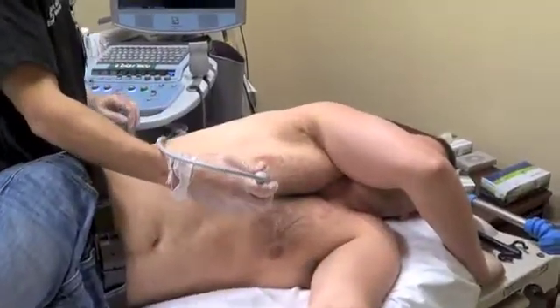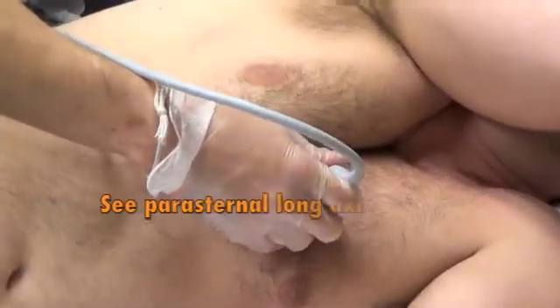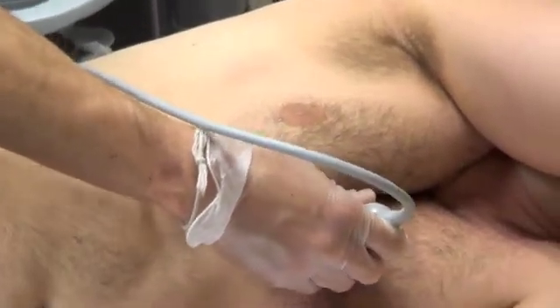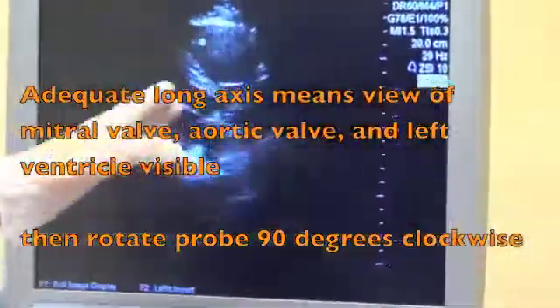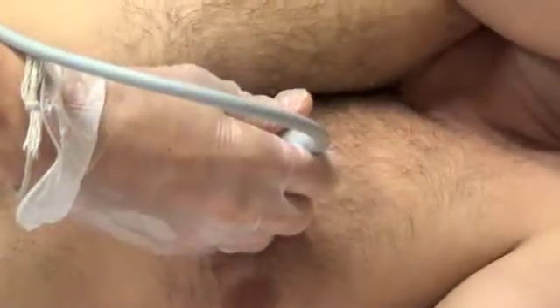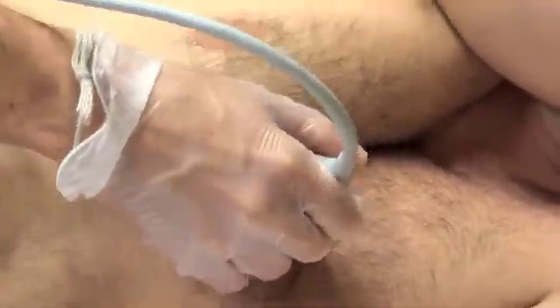The easiest way to obtain the short axis view is to obtain the long axis view first, with the transducer indicator pointed towards the right shoulder. Then once you have an adequate long axis, just over the level of the mitral valve, go ahead and rotate your transducer 90 degrees clockwise, pointing the transducer indicator now towards the left shoulder.